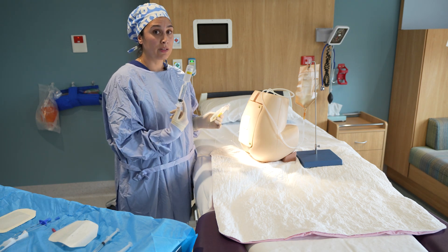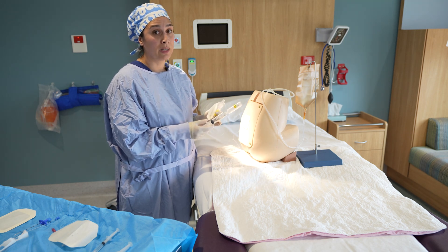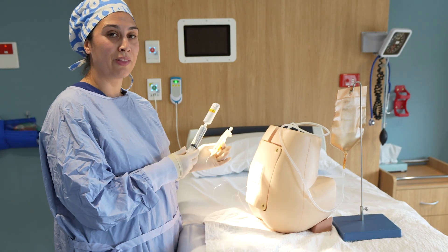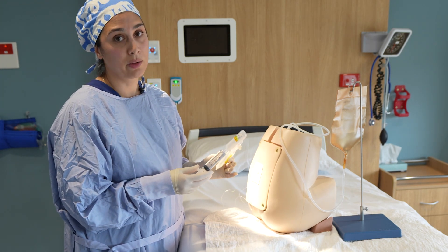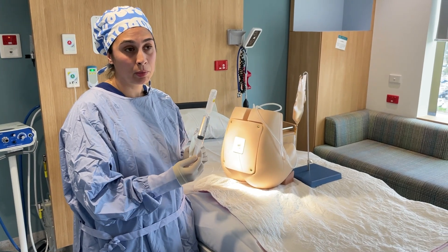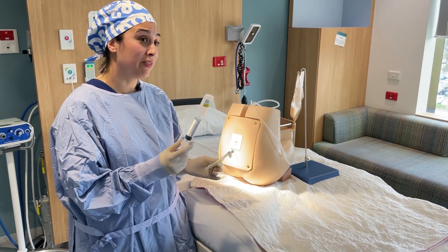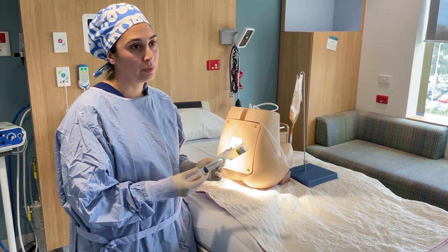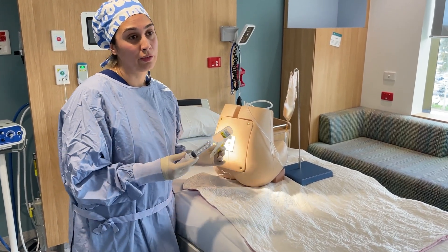At Western Health, most people use 0.2% ropivacaine after the test dose — about five mils — then wait five minutes before giving another dose. Give another five mils, allow the patient to lie on their back, start documentation, then return to give another dose after a sensory check with ice. An alternative is to combine 100 micrograms of fentanyl in 20 mils of 0.2% ropivacaine; use five mils as the test dose, then give five plus five mils at five-to-ten minute intervals.